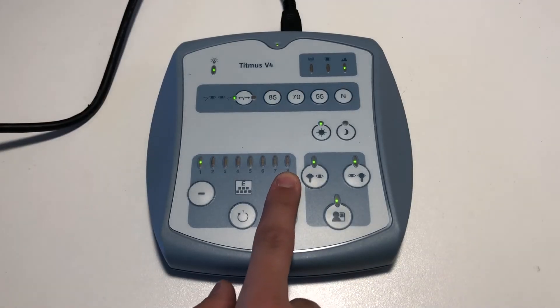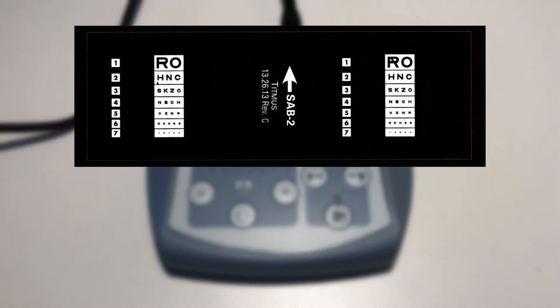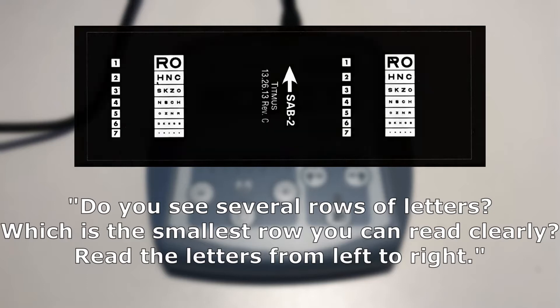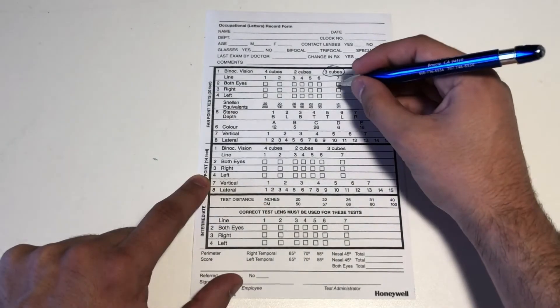Advance the slide to number two by pressing the plus sign in the control panel. This slide tests for visual acuity. Ask the patient, do you see several rows of letters? Which is the smallest row you can see clearly? Read the letters from left to right. In order to pass the test for the first two rows, all letters must be read correctly. For all subsequent rows, one letter may be missed per row. Record the last acuity level the patient was able to correctly read.